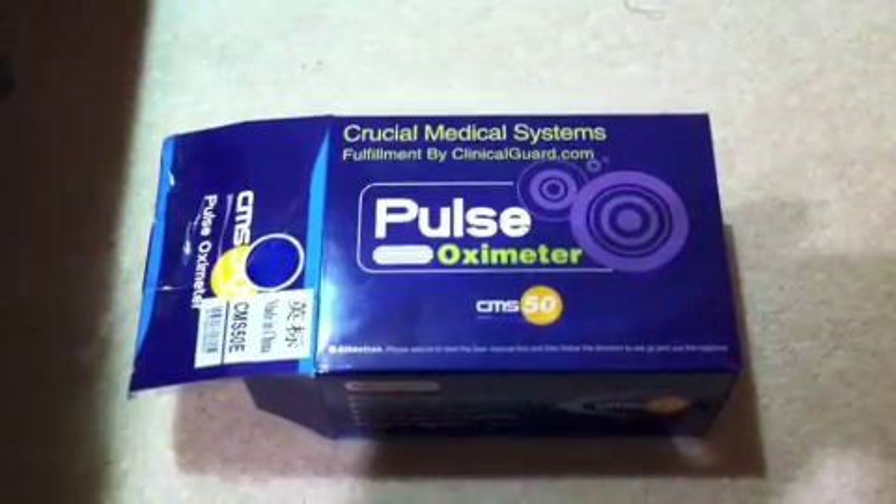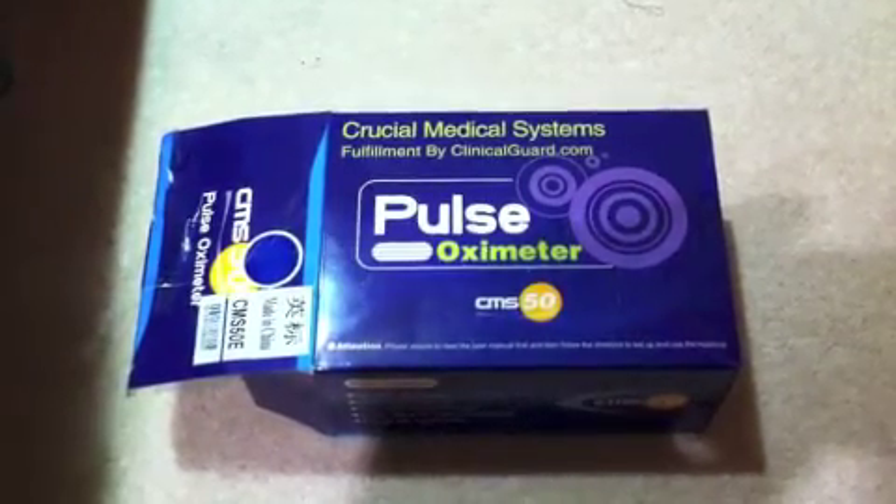I'm going to guide you through the Finger Pulse Oximeter Kit — what it is and how to use it.